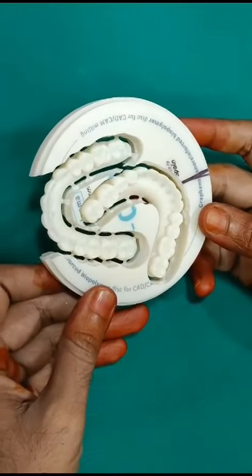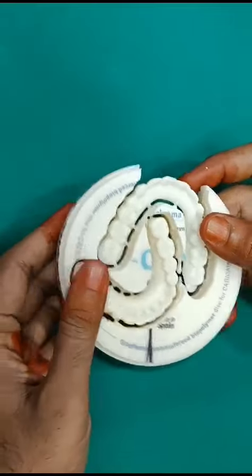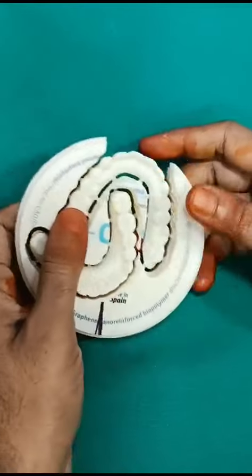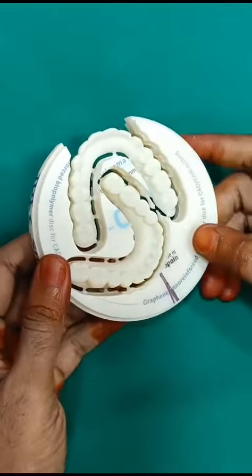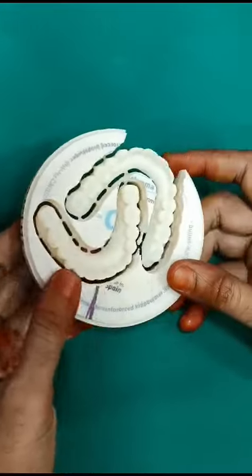This is a freshly milled G-CAM graphene bridge — you can see it is still with the connectors. This is an implant-supported bridge, a basal implant-supported bridge, cement retained.